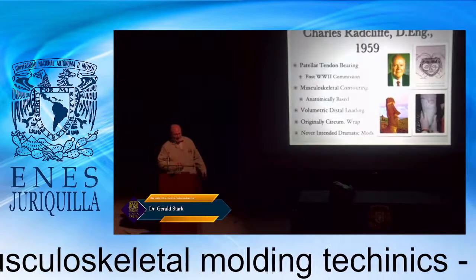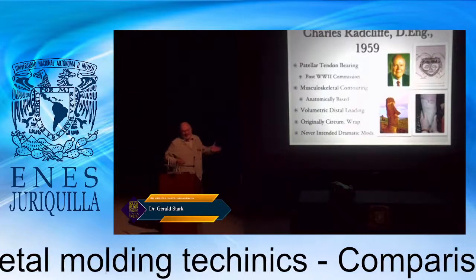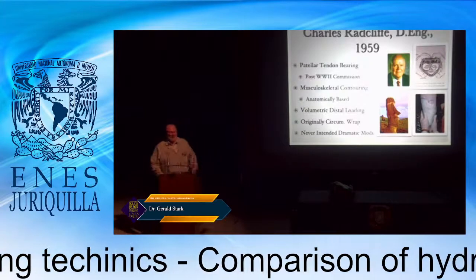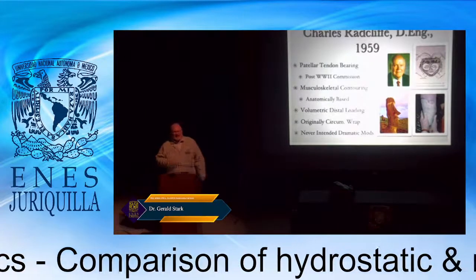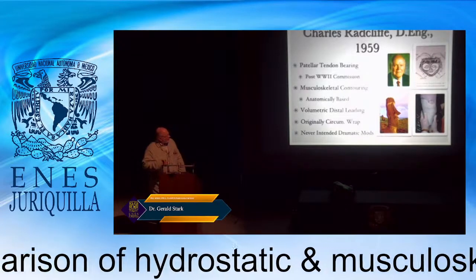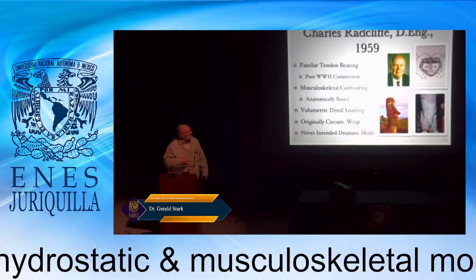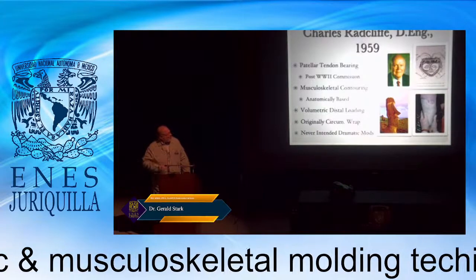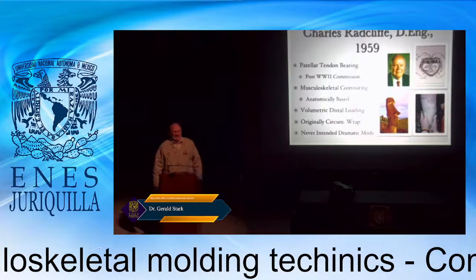Now, this is a gentleman by the name of Chuck Radcliffe, who I knew when I worked at California when I was a younger man. So that's a little bit time ago, maybe 25 years ago. And he talked about the two-stage casting technique and the patellar tendon bearing system. So you would actually load the patellar tendon because it's very insensate. You'd load the popliteal area and then custom form the distal end. And that was using the two-stage casting techniques.